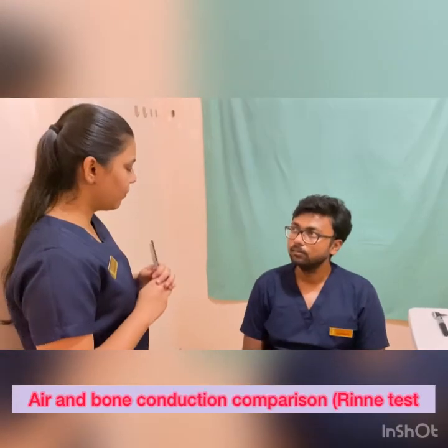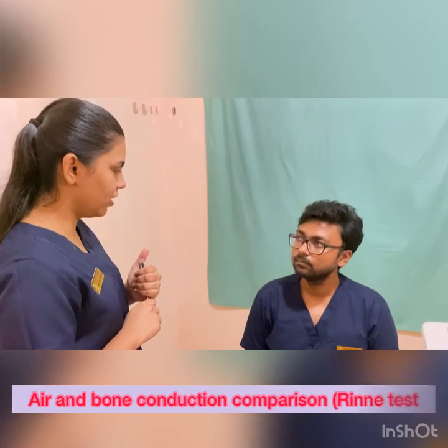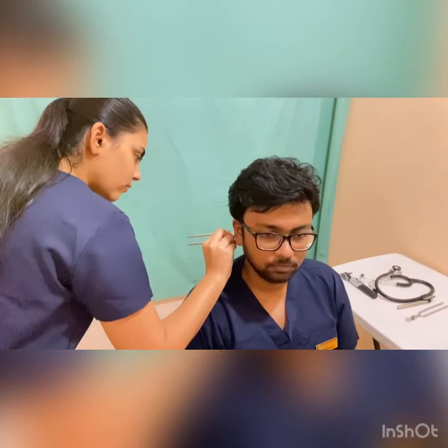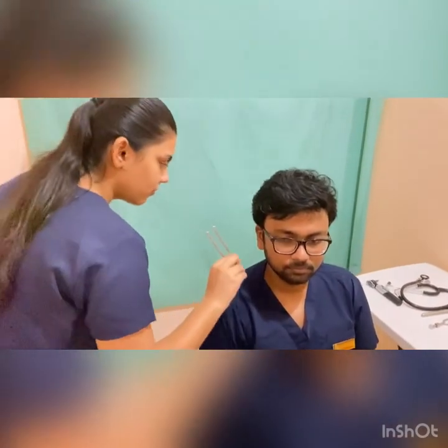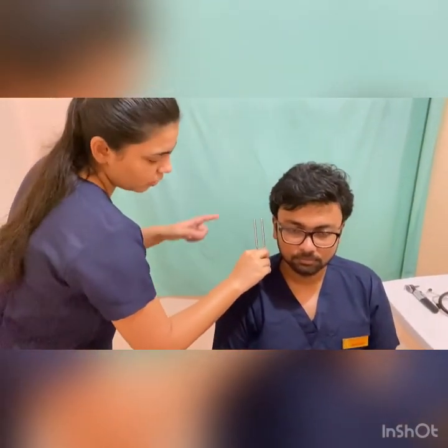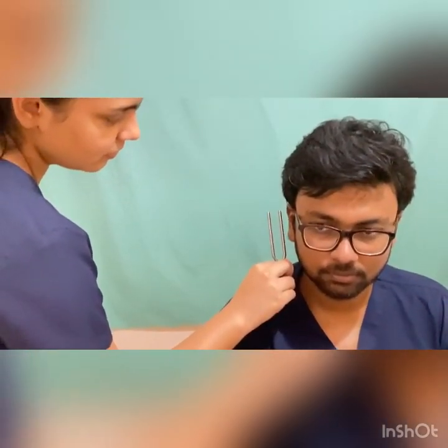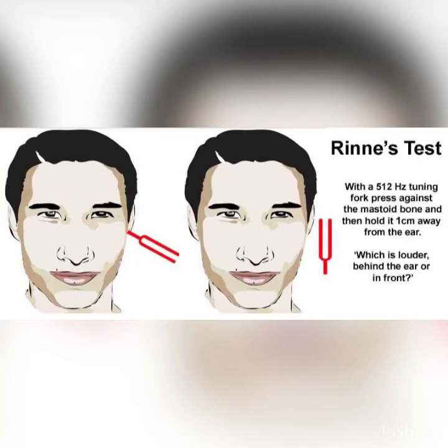Now I'll perform your test for air and bone conduction. For that, I'll strike this fork and place it on the back of your ear and also in front of your ear. You should tell me when you hear the sound. Okay? Yes. Make sure that the U of the tuning fork is always forward. Yes. Normally, the sound is heard longer through air than through bone.